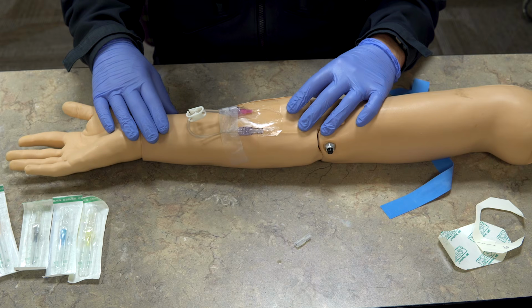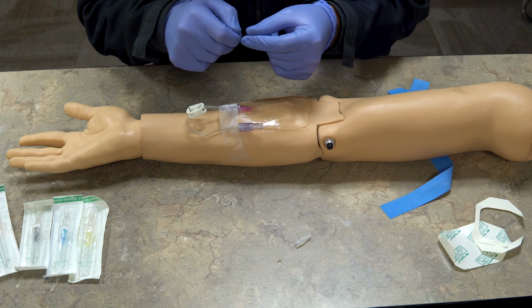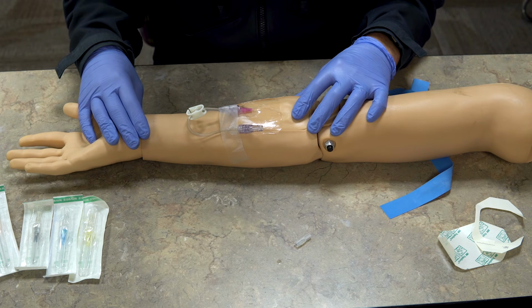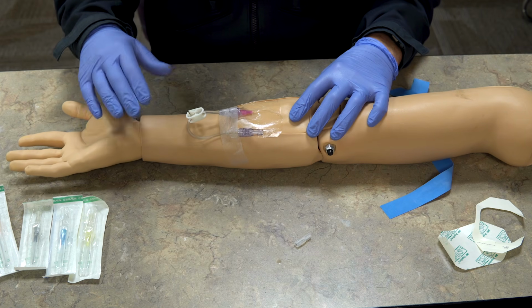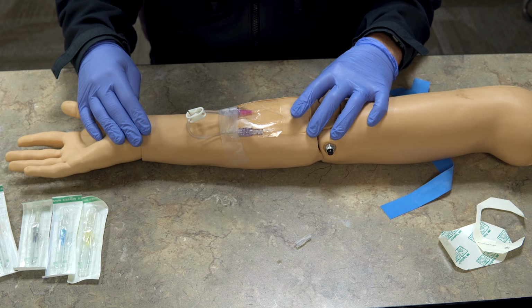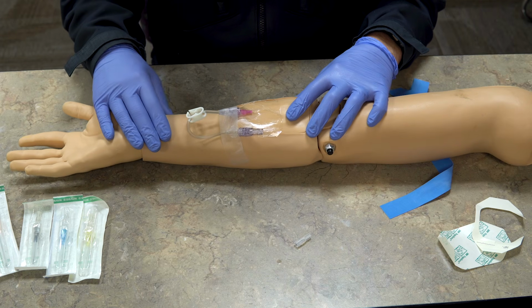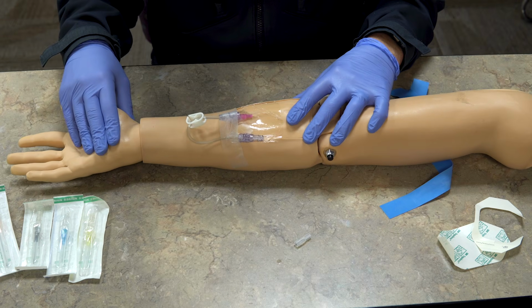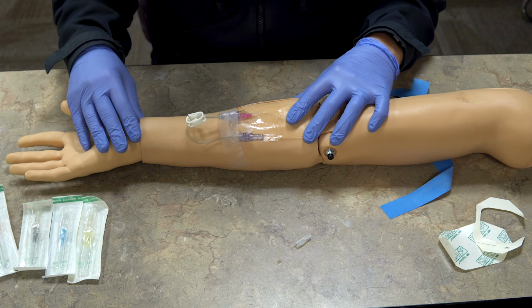Like I said before, be careful with this. There are a lot of complications. If you're fiddling with the catheter, you can shear off the tip of that little plastic piece in the patient and cause a catheter embolism. I've never seen that happen. I've never even heard of it happening, but it is a risk. Infections, the big one, cellulitis, things like that. There are risks to this procedure, even though it's relatively commonplace. So not everybody needs an IV, and I wouldn't say this should be number one on your list for prepper items if you're preparing for the end of the world, but some good knowledge to have regardless.